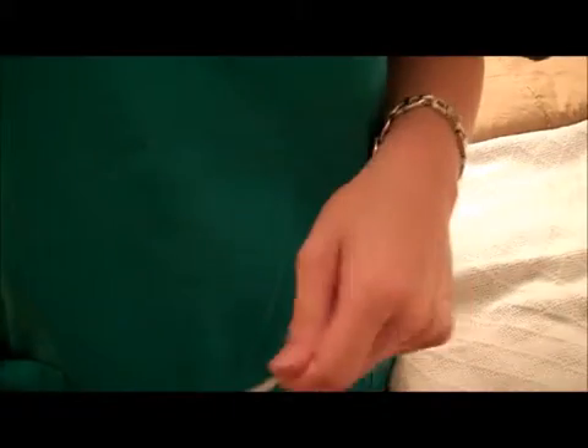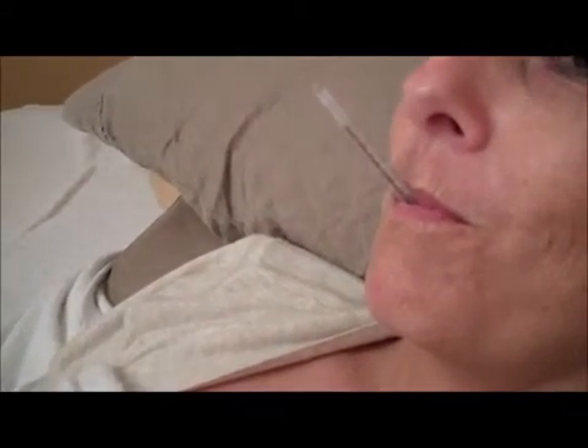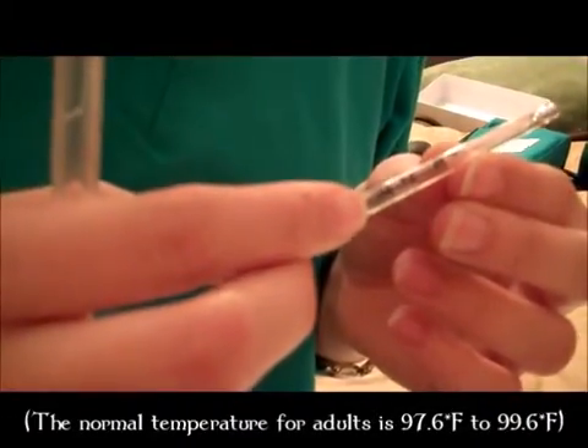Take your mercury thermometer and shake it by flicking your wrist until the mercury line in the thermometer reaches below 96 degrees Fahrenheit. Then, place the tip of the thermometer under one side of the tongue and towards the back. Leave the thermometer in the mouth or hold it there for three minutes. After three minutes, remove the thermometer and locate the mercury line inside the thermometer. Then, record your results.